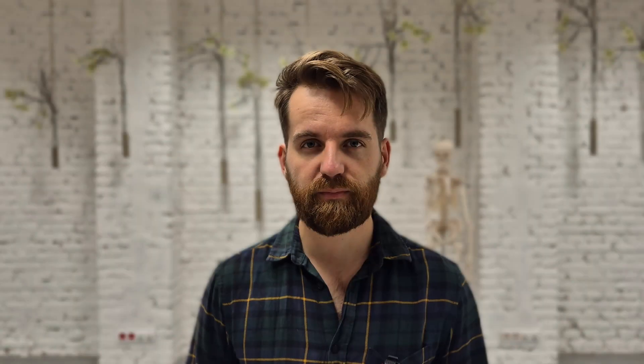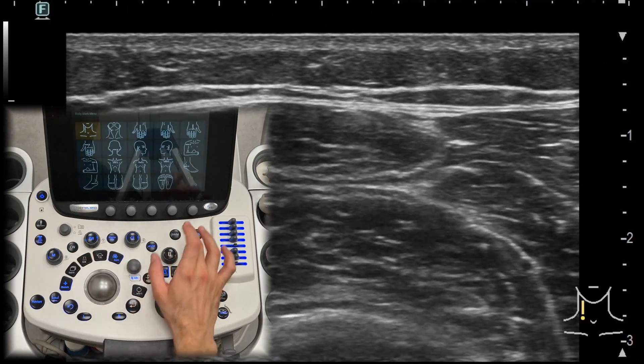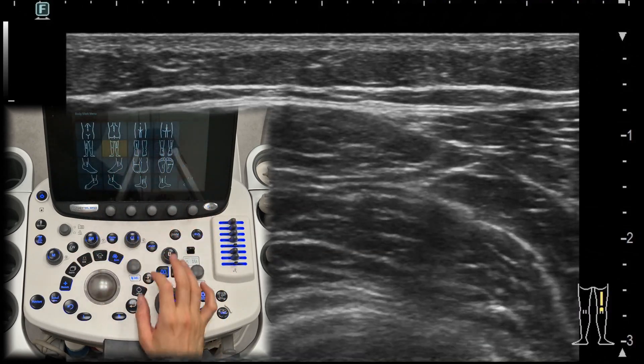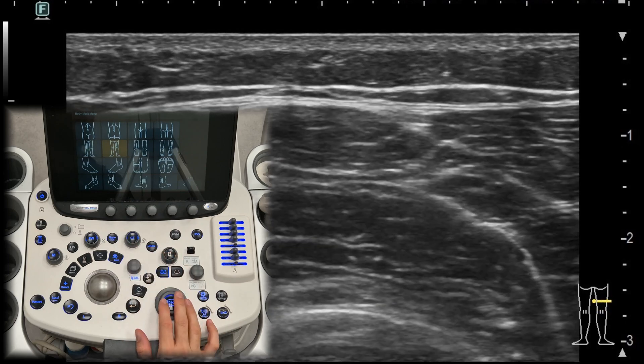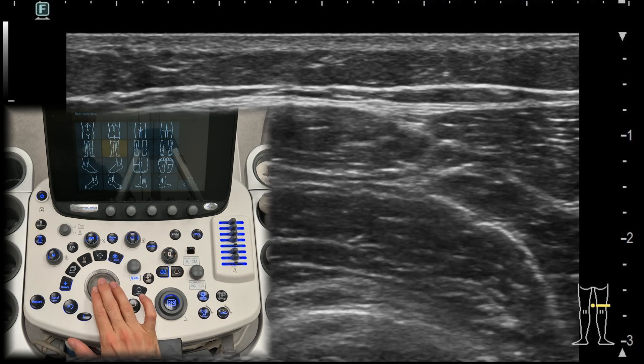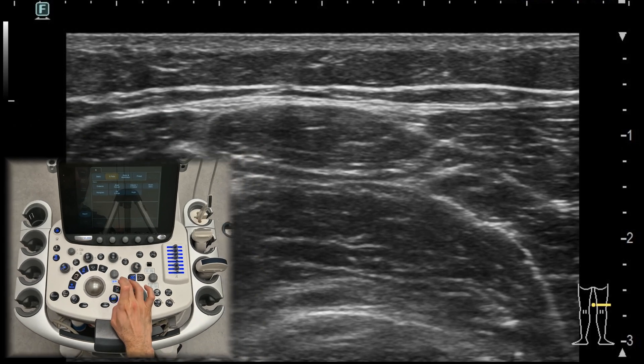Pictograms. Pictograms are small icons on the screen that represent different body parts, helping you orient your scans correctly. You can adjust the position of the probe with the trackball, and the angle of the probe can also be adjusted. Selecting the appropriate pictogram makes documenting and communicating your findings easier and more accurate.